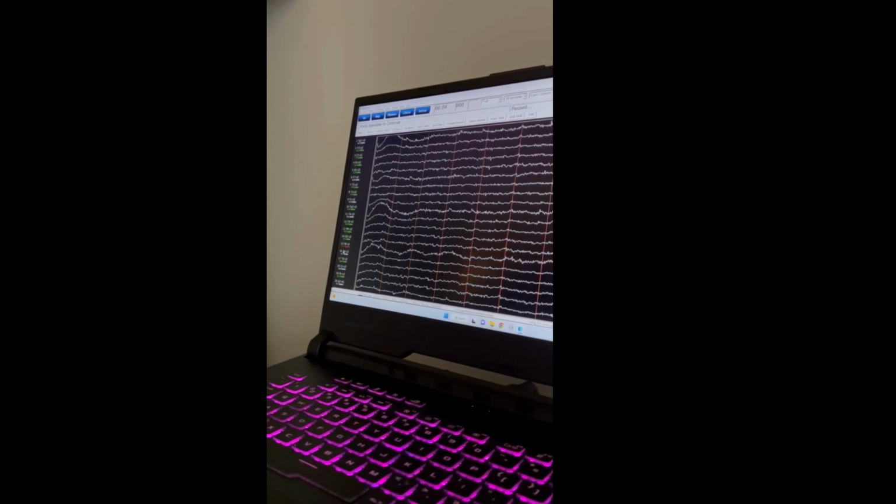This red here, the general rule of thumb is you would like for all of your impedances to be under 5 and below, which means a lot of them will be white. Well, all of them will be white. The green from 5 to 10 is acceptable.